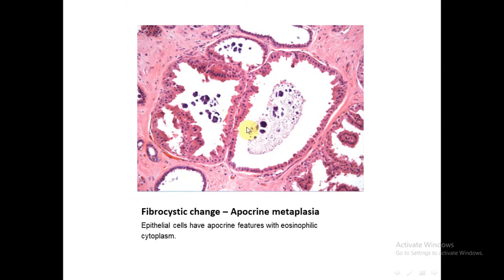This is apocrine metaplasia, in which the presence of apocrine cells is associated with benignity and is an indicator of benignity. These apocrine cells line a cystically dilated duct. These cells are large cells with eosinophilic cytoplasm and prominent hyperchromatic nucleus. These are apocrine cells.